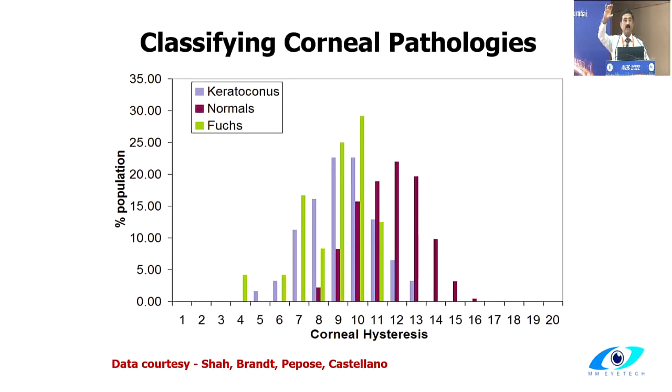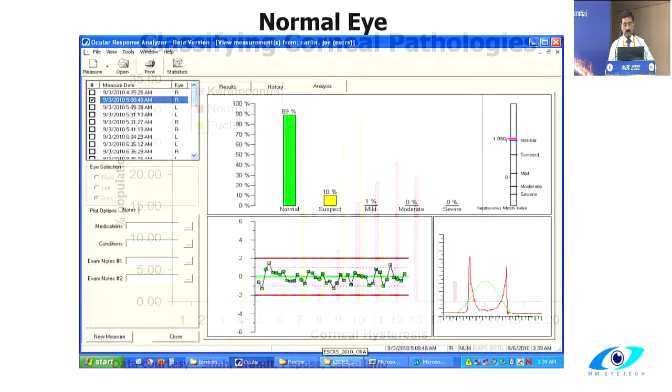So if you just measure the thickness with a pachymeter or with any other device, you can say, this patient has a 600 cornea. He may actually be having a little bit of endothelial dysfunction, but you put him on the hysteresis value on the machine, and you'll come up with a value of 6.5 or 7. And that will tell you that this thickness is not genuine. So these are the other values that it comes in.